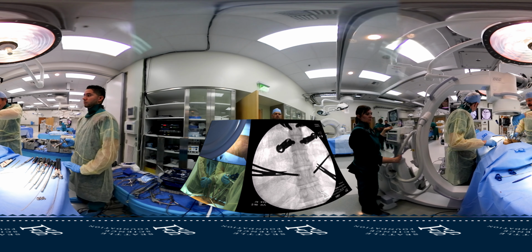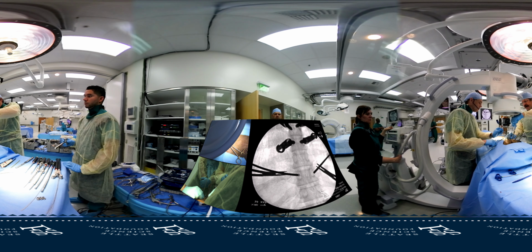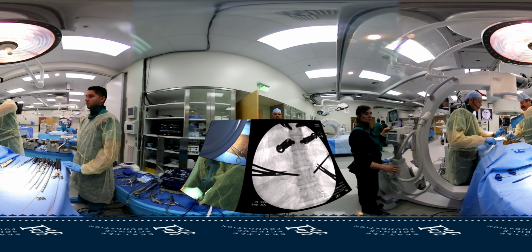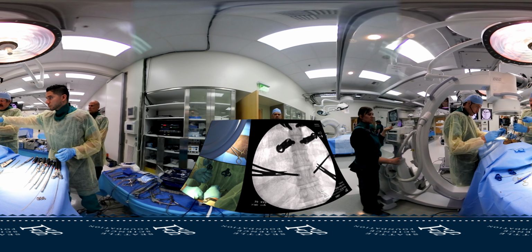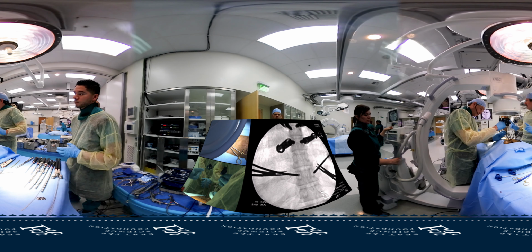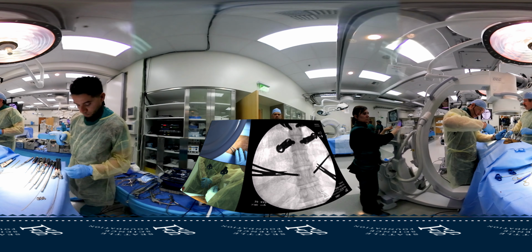So I'm at 9 o'clock. So I want to start there, and a lot of times I can put it in by hand to start it. Go ahead and give that a couple taps. Or I'll just give it a couple quick taps. Good. And all I want to do right now is set it in the bone.